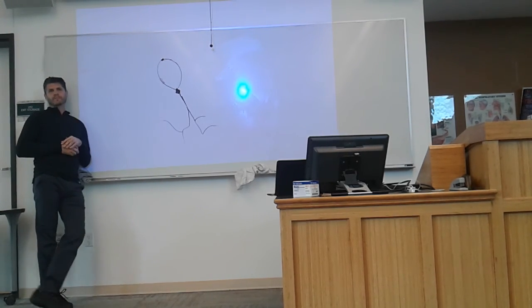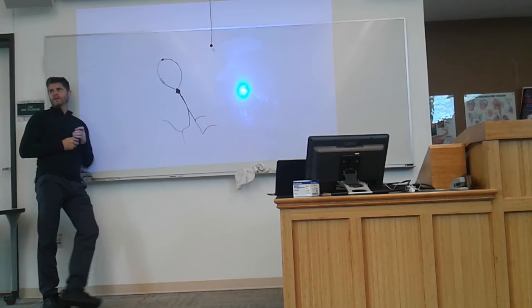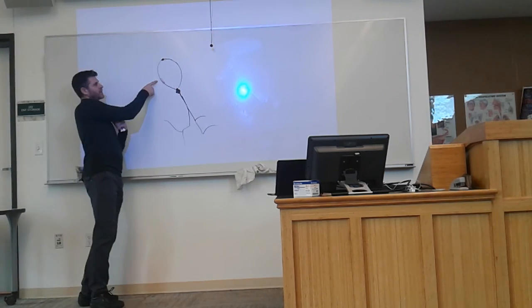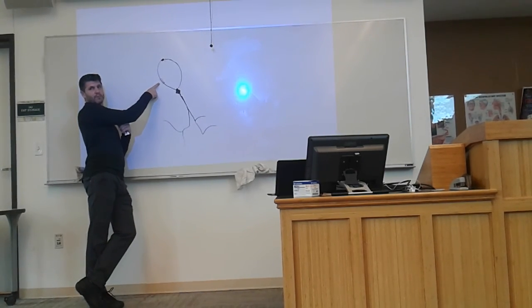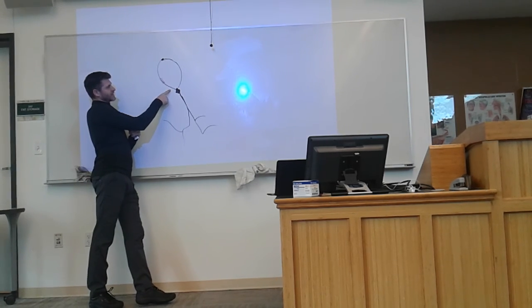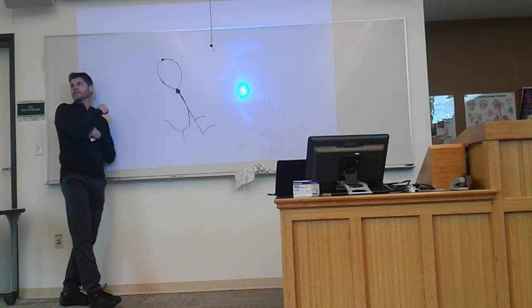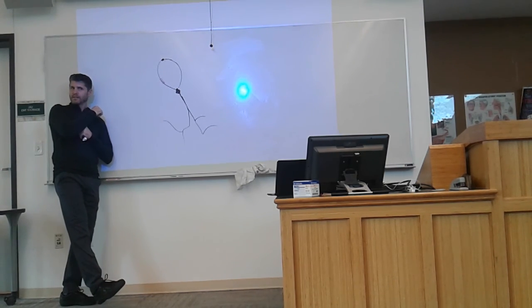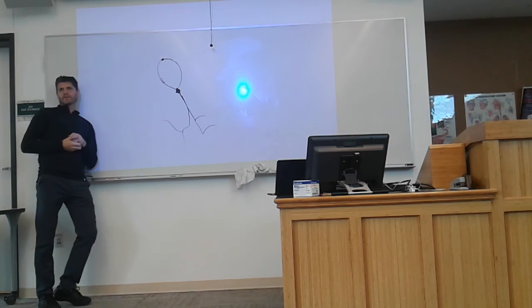Do you understand what I'm saying? The cells after the delay will go around the block. So this delay that we have here is definitely a delay, more than normal. But this line of track right here is still being depolarized by this, because it's not such a delay that it can't get that done, rather than coming backwards from the AV node.